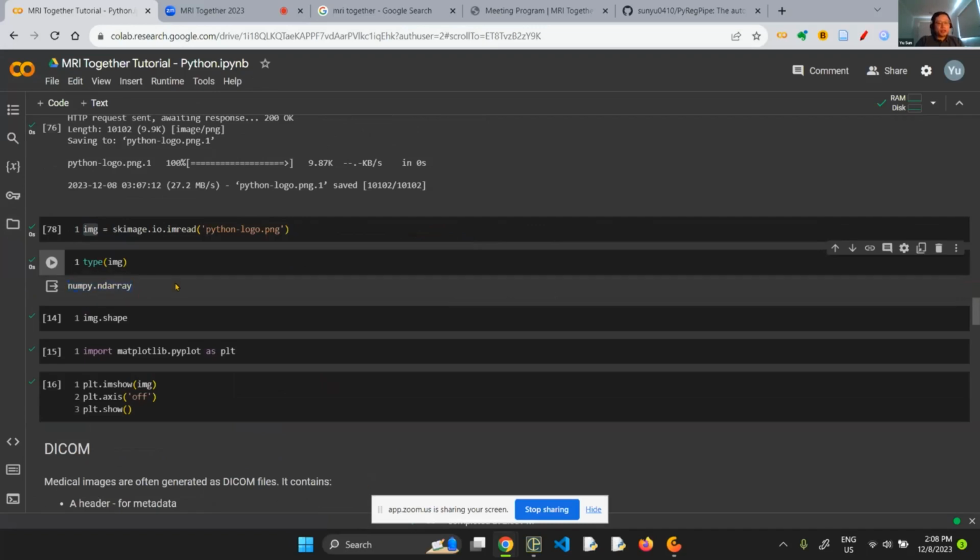The NumPy ndarray is sort of like the currency in scientific computation. If I want to swap some rice with, say, paper, I need to use money. So that ndarray is like that money, the currency that we use to trade things. Usually in the workflow you will read things into a NumPy array, then do processing, say machine learning or deep learning, and then get the result. Everything after reading will basically be a NumPy array.